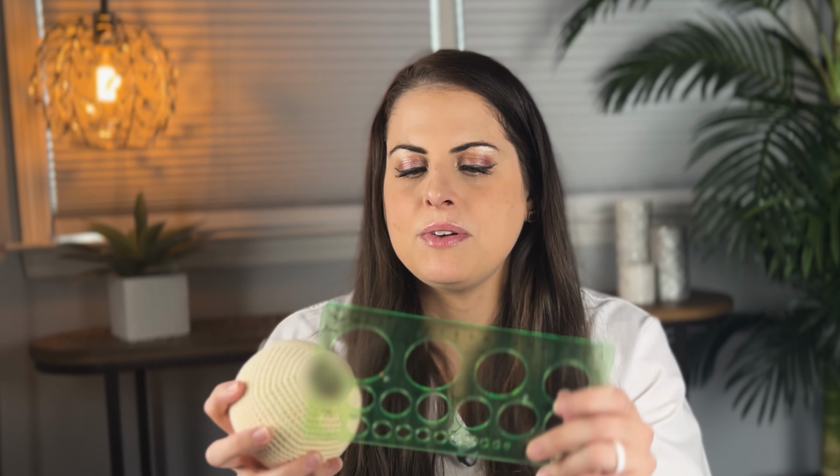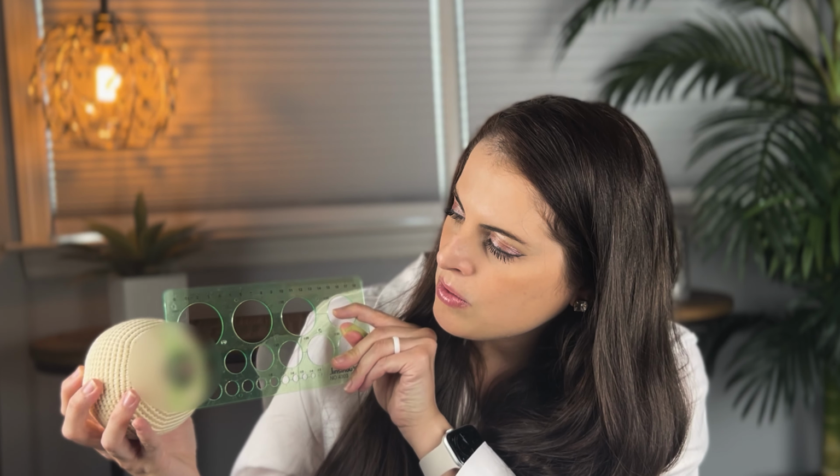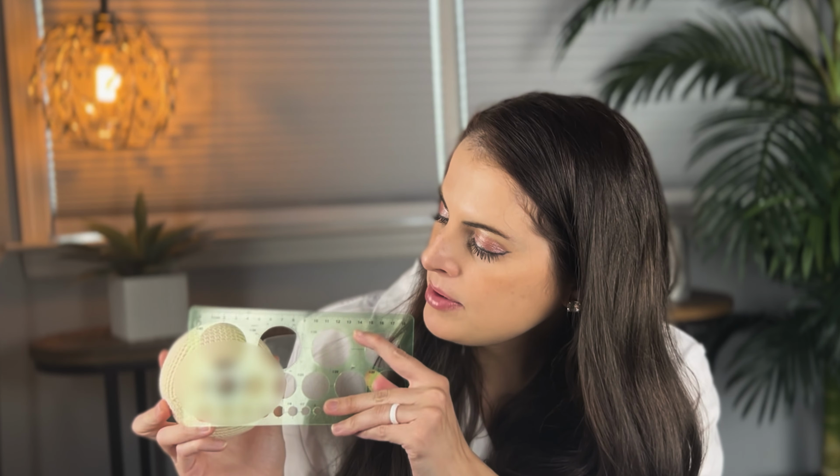So this one is a 20, and it's a little bit big because it's still pulling some of the areola into it. I would say that this breast model fits best in an 18 or even a 16. That way it will not pull any areola into it, and it gives a nice snug fit, but you want to be able to fully fit the nipple in. So I would say for this model, it would be an 18. You're going to get this ruler and do the same thing on your own chest to figure out what flange size you are.